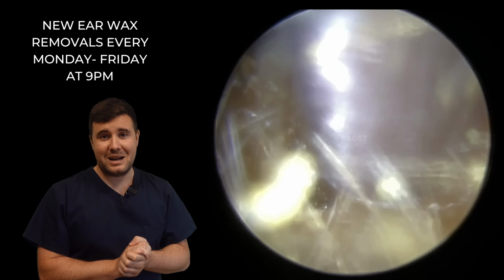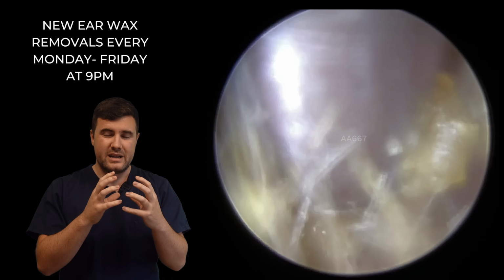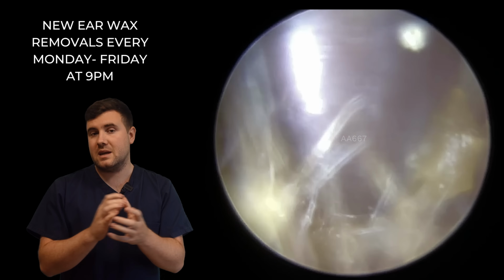So again, you can see we've got these long hairs and cilia that are just in our way. So we have to work really carefully here. And these drier plugs of wax can sometimes be quite tricky to get a grip on. Now we're just trying to wiggle this in different directions just so we can loosen this away, and I think we've just managed to loosen this away. Yep, we can see there's some movement there now.